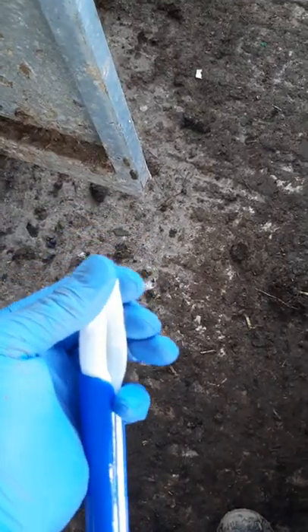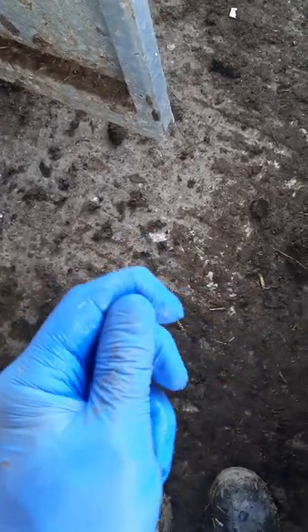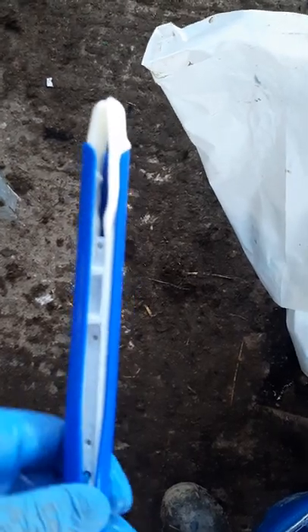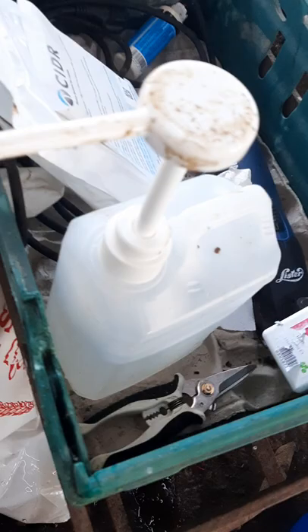Close the ends of it — there's just a little bit of a bump here which I use as a backstop. So that's now inserted. See the CIDR's closed nicely. Tail's pointing downwards. Bit of lube off my pump. That's the applicator and CIDR lubricated.